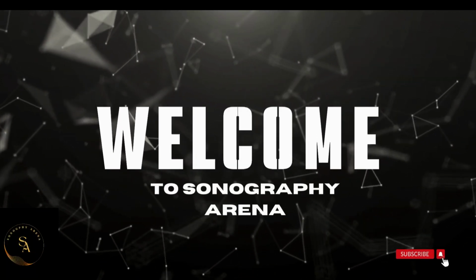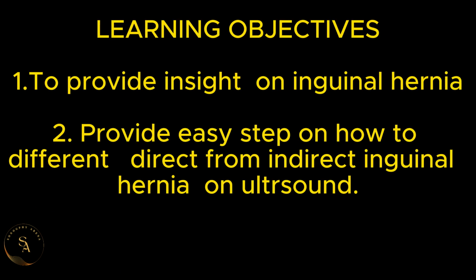In this video, we are going to learn about inguinal hernia and how to differentiate direct from indirect inguinal hernia. A lot of people find it difficult to differentiate these two forms of inguinal hernia on ultrasound, but it's a very simple thing to do on ultrasound. All you have to do is to follow this simple method I'm about to show you in this video.